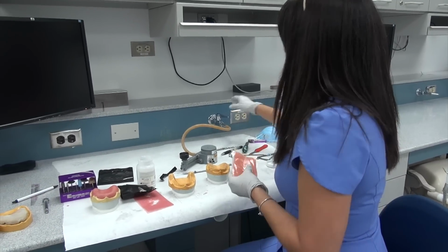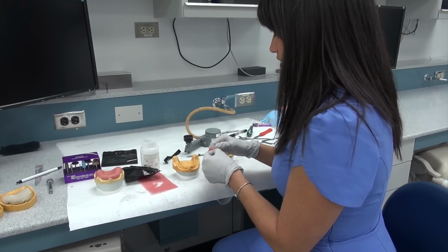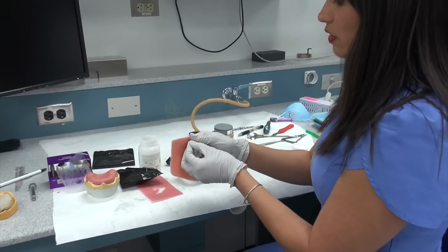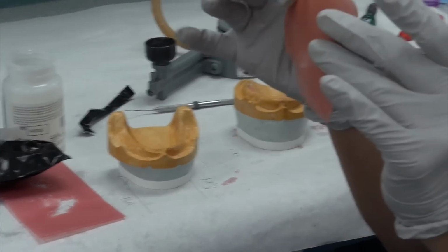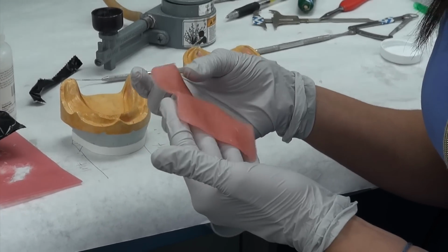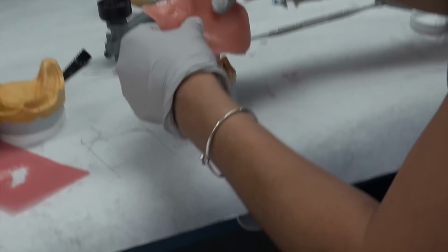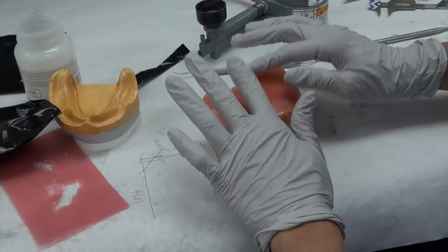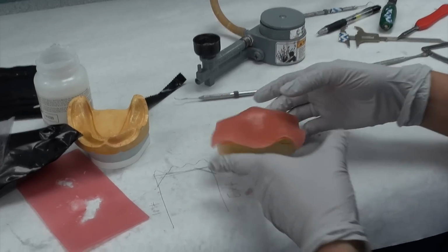So let's turn that off now. Okay, so same as before, just as you unwrapped it. Now one of the things you'll notice is this material is a lot more pliable. The more you touch it, the more flowable it gets, so you want to put it down right away. It won't be as hard as the clear material.